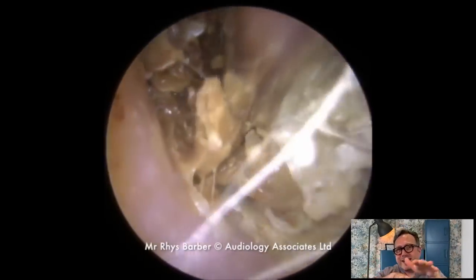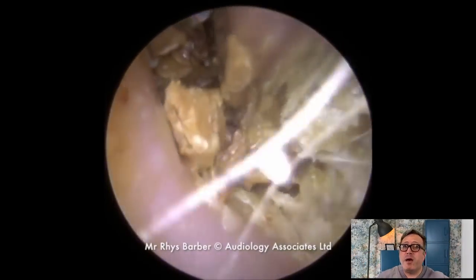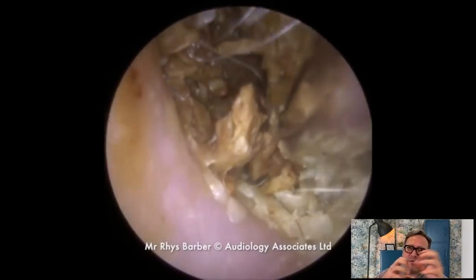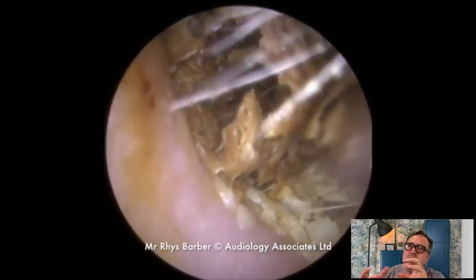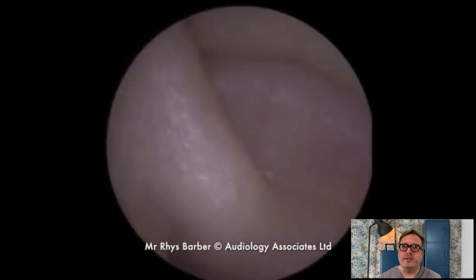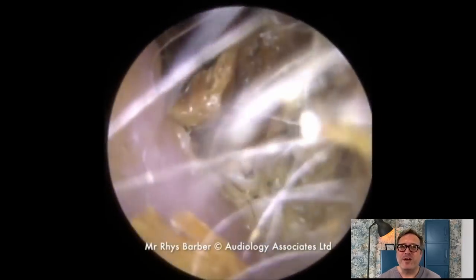Because we've got all these layers one on top of the other, as the jobson horn goes in it just pulls those layers apart. What you end up with is lots and lots of little pieces all separating out. But it does help to loosen this bundle of skin, which can sometimes be really difficult to pull and tease apart. This is why this one's a really, really interesting one — it's one of my faves.